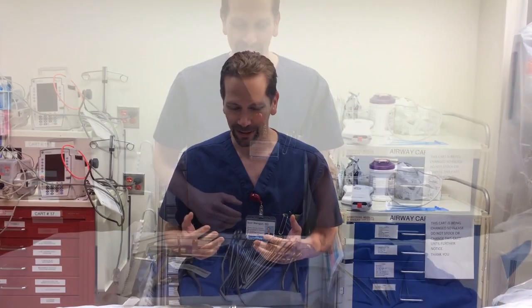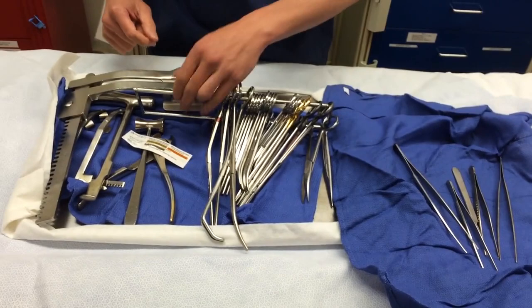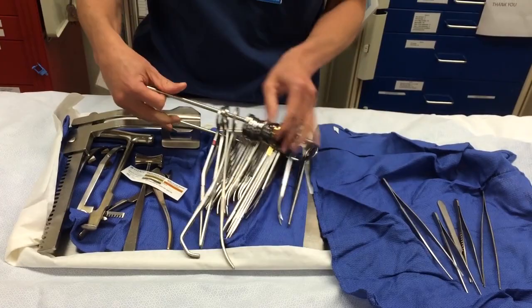I was asked the question: if I was going to build an ED-specific thoracotomy tray, what would it include? We have an actual thoracotomy set used for traumas — it's a panoply of instruments, and it is complex for folks not used to it. So let's build ourselves an ED-specific thoracotomy tray.